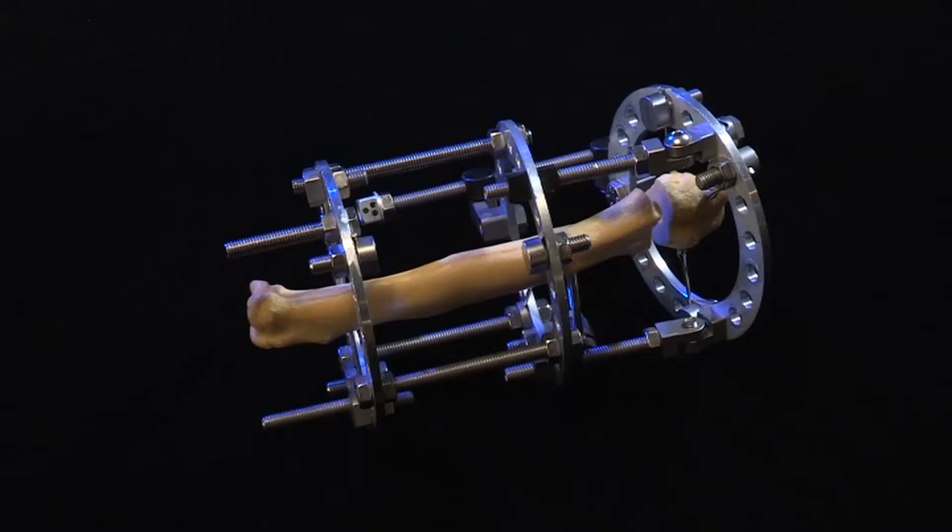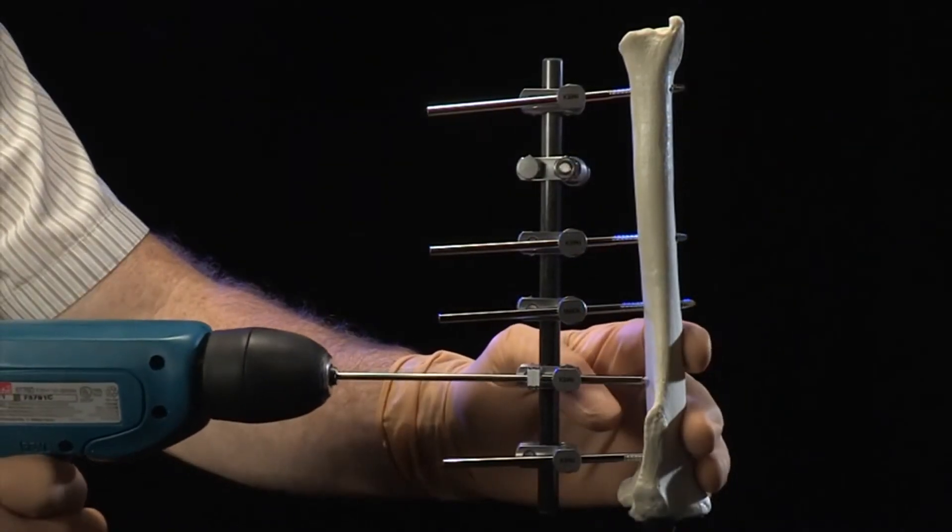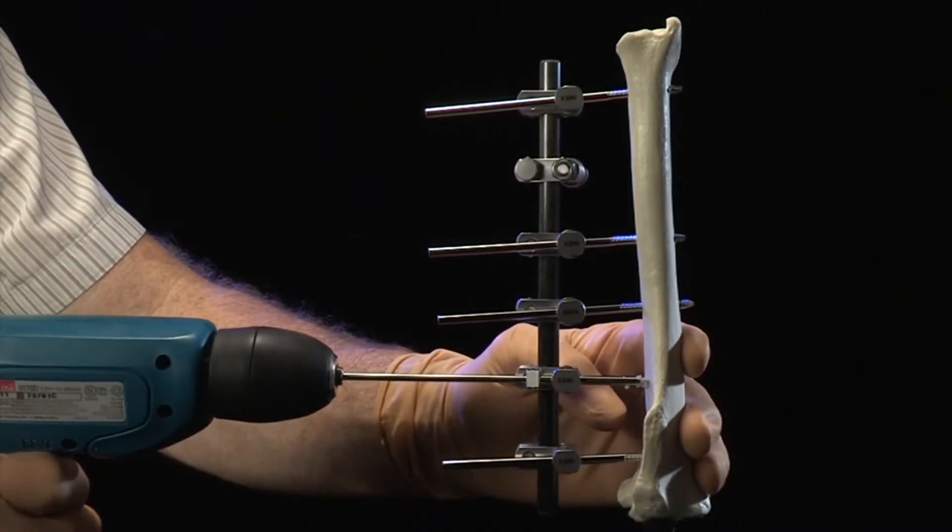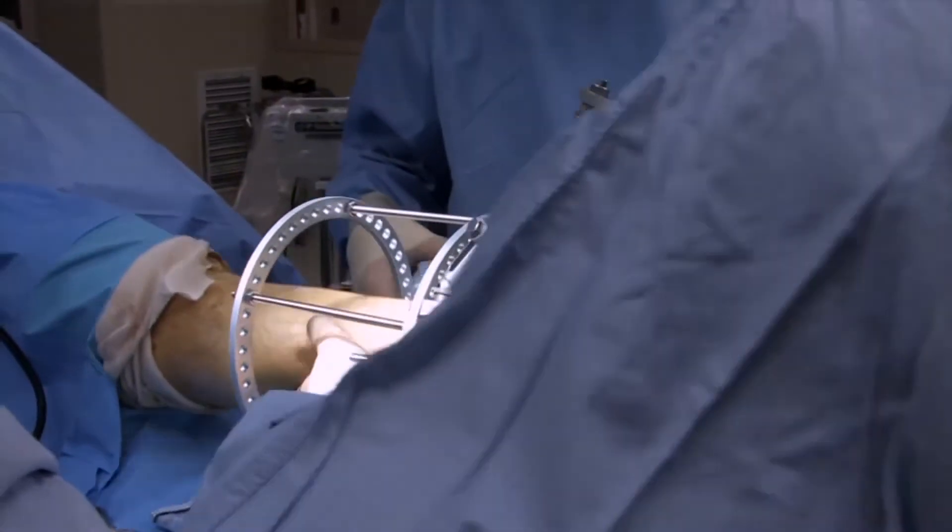It's easy for us in practice to maintain a reasonable inventory of parts and we can swap things in and out. The clinical advantages of external fixation include versatility of use and construct design, minimally invasive application, and ease of making post-operative adjustments.